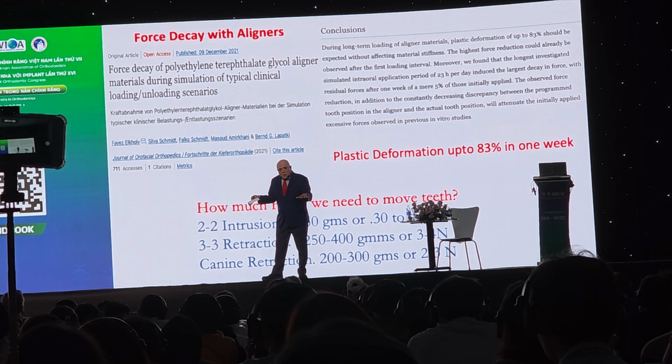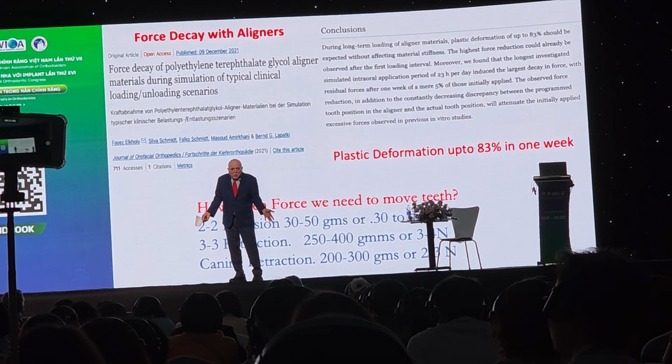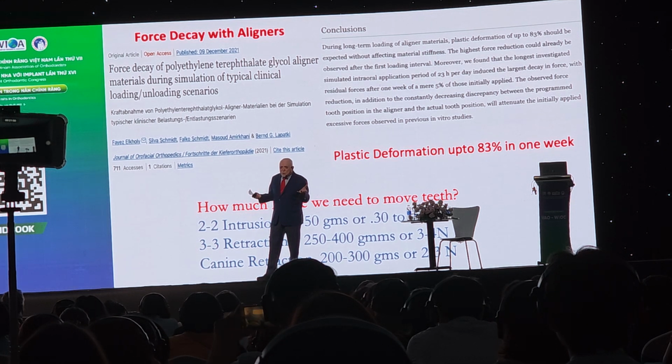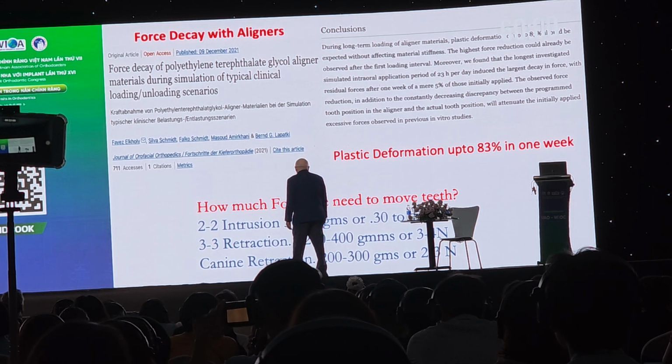I have nothing against Invisalign, because without Invisalign you would not be standing and talking about it. But what we are saying is that the company's emphasis has been totally different over the years. They didn't change the material. Material basically remained the same.